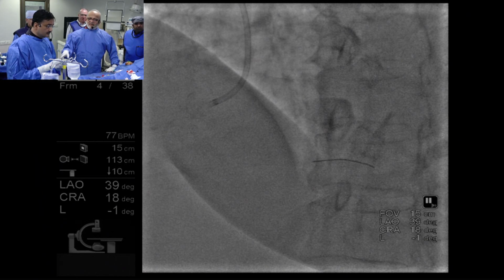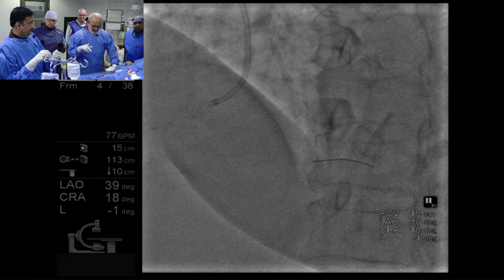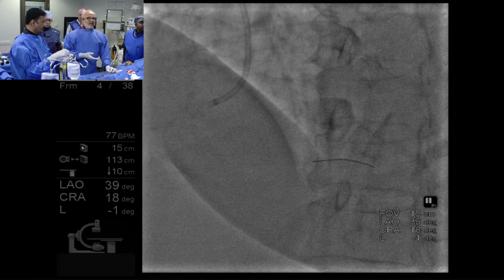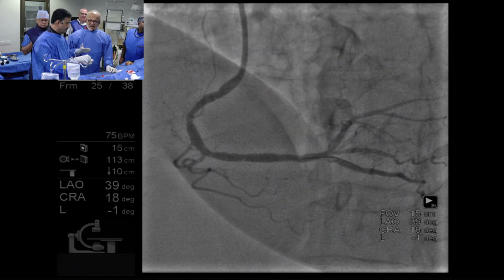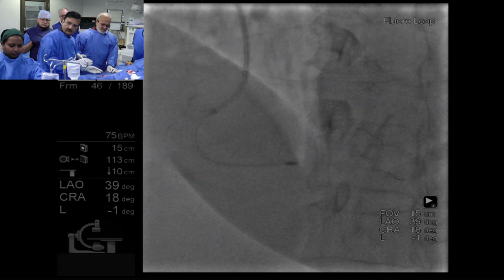Balloon trapping, Sanjay, please explain. Yes. You know, the young guys in the audience, most of the senior guys know about this, but this technique is worth learning because it helps you whenever you are doing this type of exchanges.